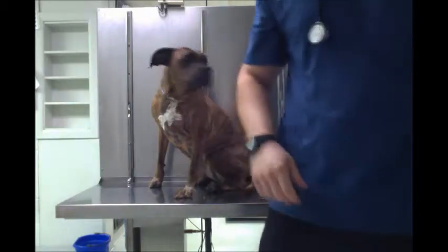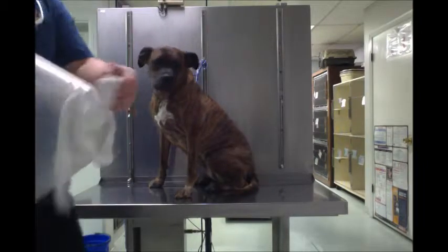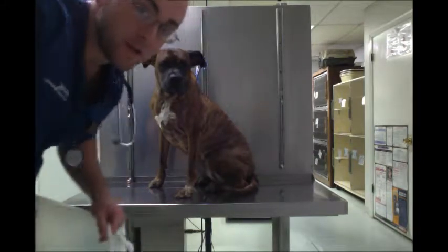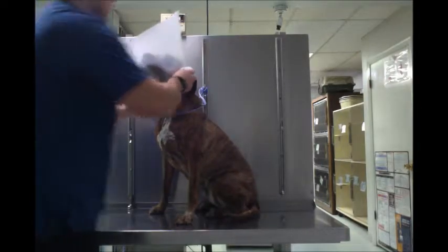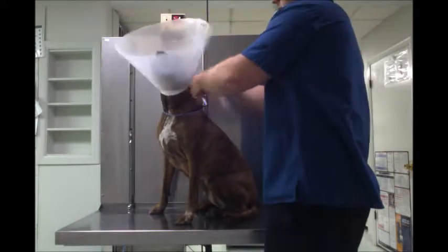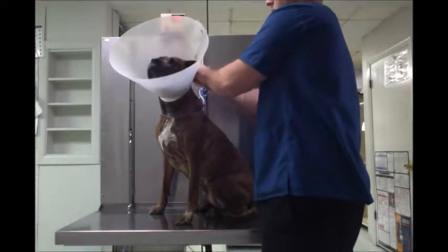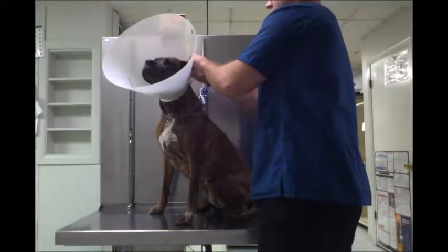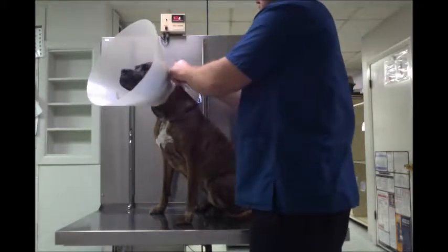Next I'm going to apply an e-collar. This is for anybody who's messing with stitches or anything like that. I've already got my gauze wrapped into the e-collar, so we're just going to go ahead and apply it to her. Really straight over her head. And then we're going to tie it in a knot that you can easily untie if it were to become tangled on something. So it's just a simple little tie like you would tie your shoes. Take that off.